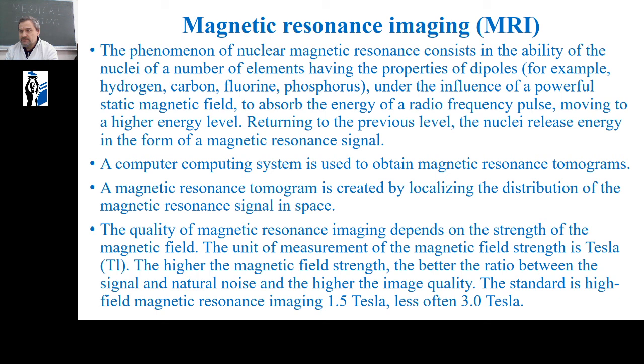A computing system is used to obtain magnetic resonance tomograms. A magnetic resonance tomogram is created by localization of the distribution of the magnetic resonance signal in space.